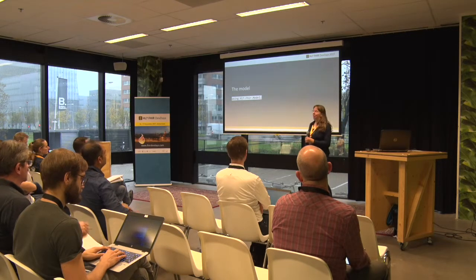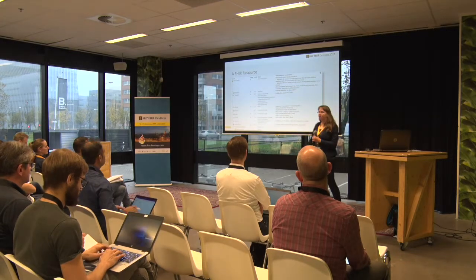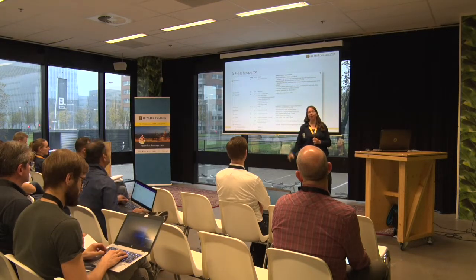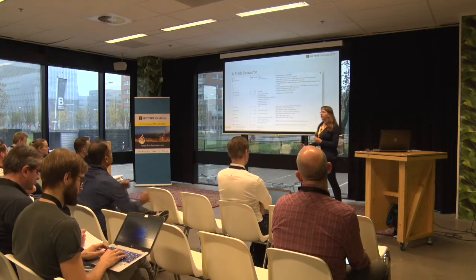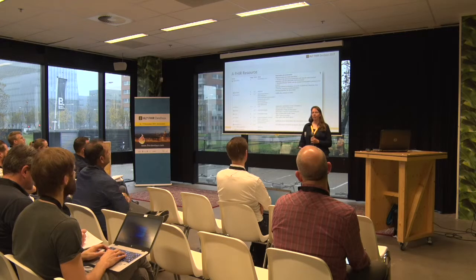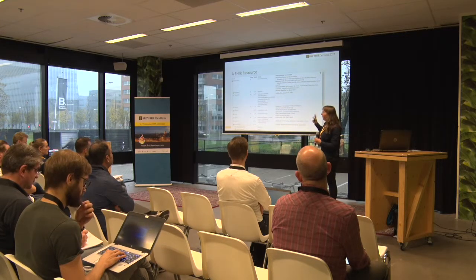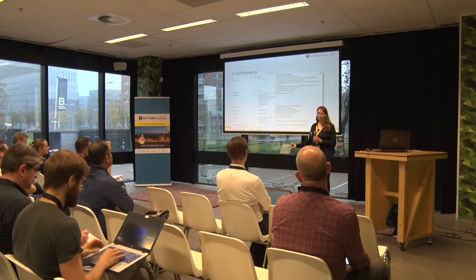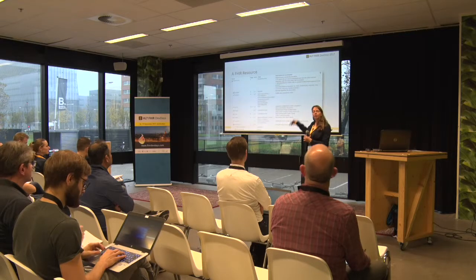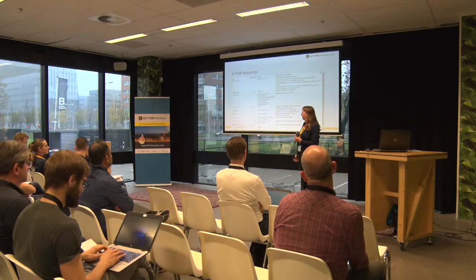You put a using statement on top, of course, and then, a sidestep to FHIR itself. This is a screenshot from the FHIR website. As you've probably heard from Richard earlier or have experienced yourself already, for each resource you have the specific definition for that resource on the website of the FHIR specification. So you can look up all of the fields that are available and the cardinality of those fields as well.